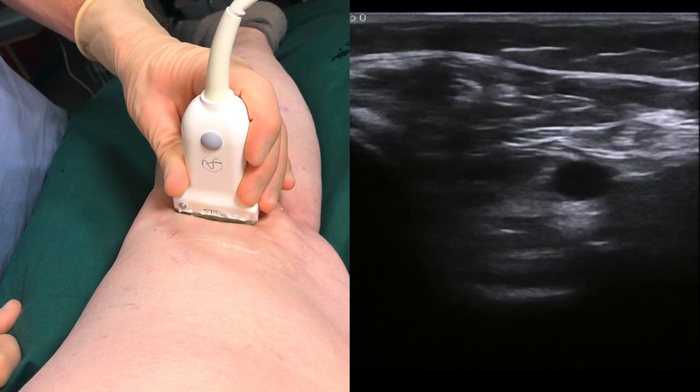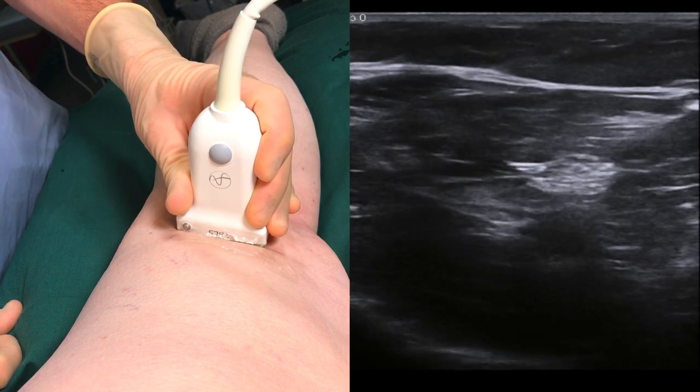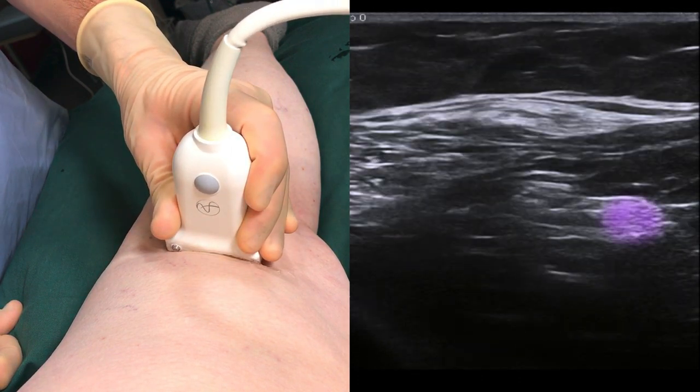Place the probe in the popliteal fossa, just lateral to the midline. Slide the transducer cranially in order to identify the hyperechoic tibial nerve, here marked in purple. The nerve becomes easier to identify as we approach the point where it merges with the peroneal nerve, also marked in purple.